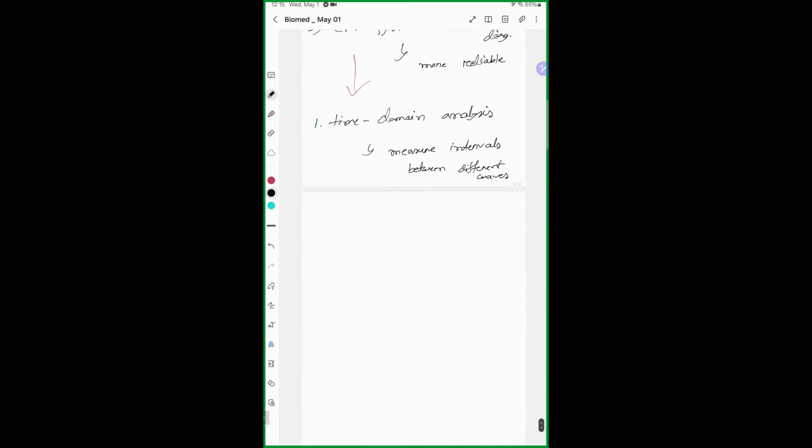We'll see next what issues can be identified from this time domain analysis. If you have the signal in MATLAB, you can easily measure.